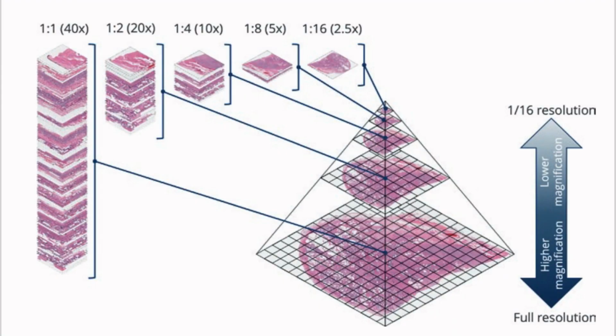Since a couple of years, software like QuPath and others can address the problem of images generated by scanners of histological slides, because the obtained images are gigantic, and thanks to the pyramidal storage we can now navigate seamlessly through whole slide images. And this was the beginning of serious image analysis to be performed on whole slide images.